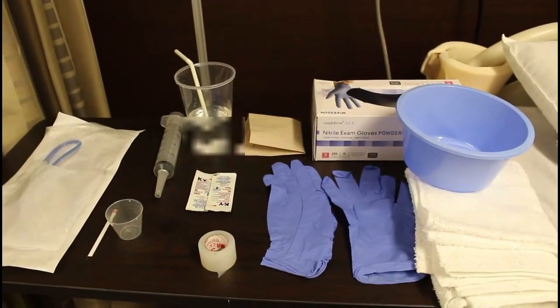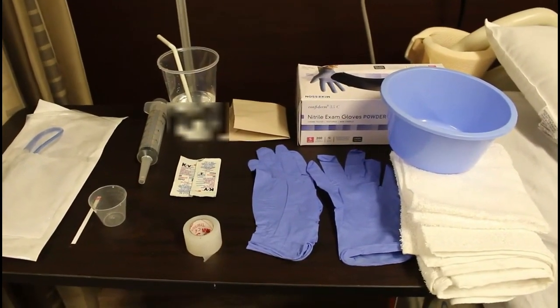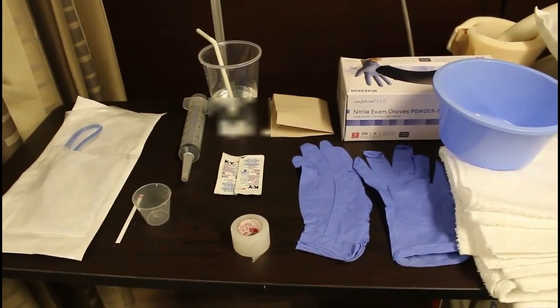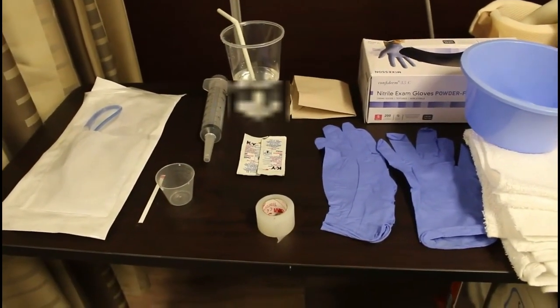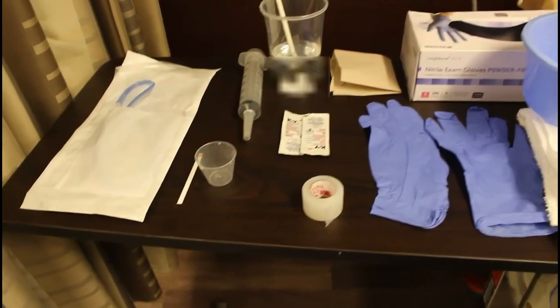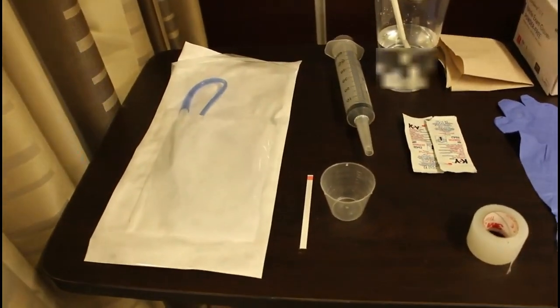Here are the supplies you'll gather for your NG tube setup: an emesis basin, a washcloth and a towel, non-sterile gloves, a tissue, a cup with water from the sink and a bendy straw, lubricating jelly, tape, a 60 cc syringe with a blunt tip, a measuring cup, pH paper, and your NG tube.